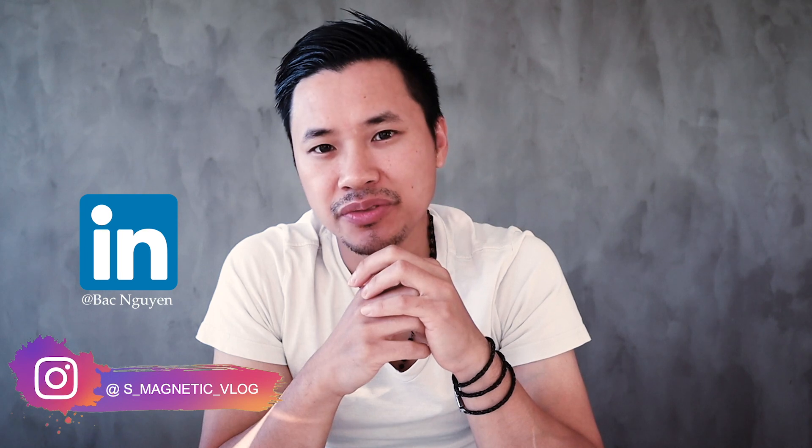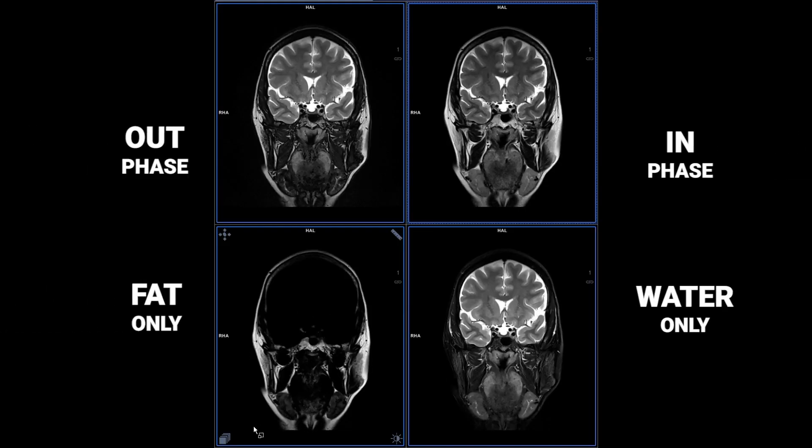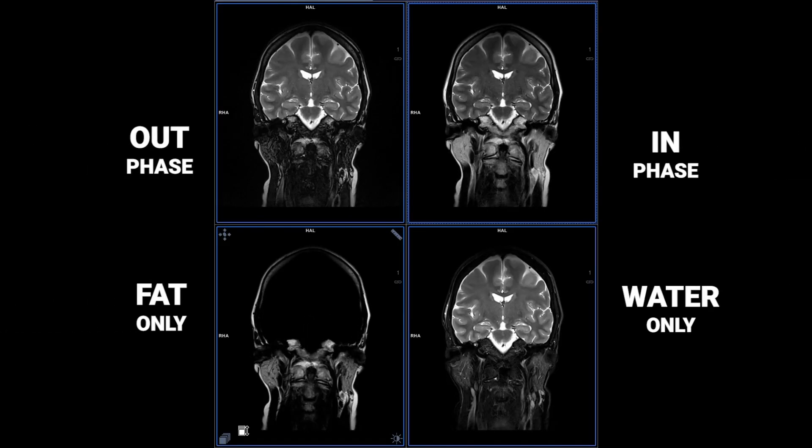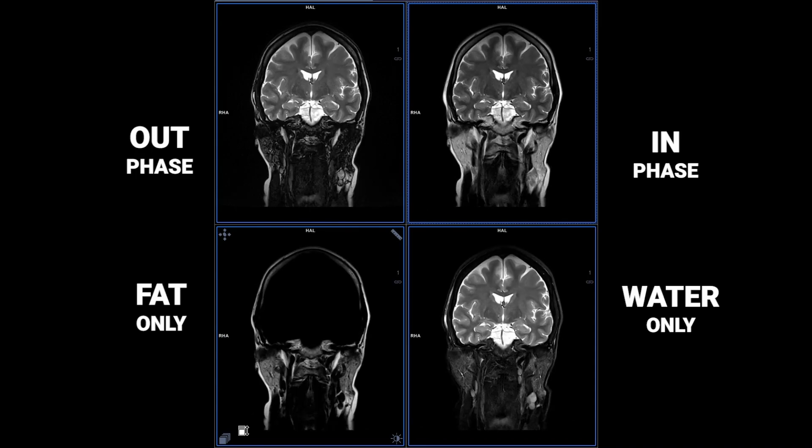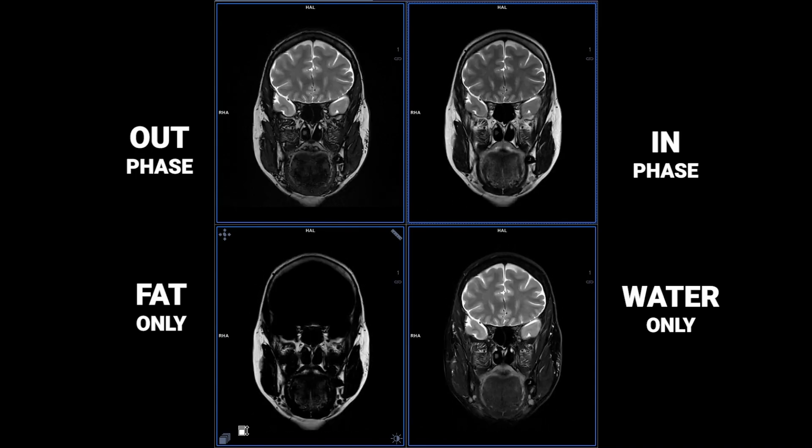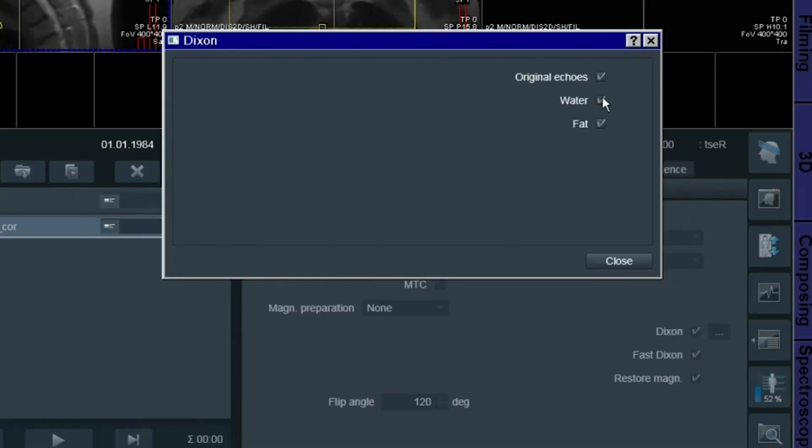Probably you've done MRI Dixon before and you know you have the four images: in and out of phase, fat only and water only. But this is something you have to order or tick on before you do the scan, right? But let's say you forget to tick on the in phase and the scan is done and then you regret. Should you do another rescan? Probably not. You have a way to work around there, so I will show you today. Let's go!